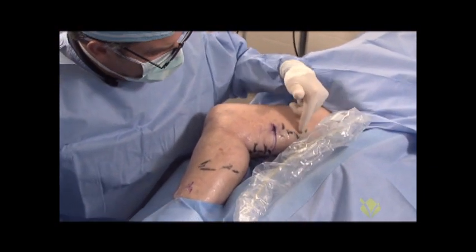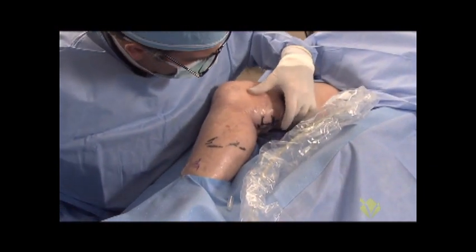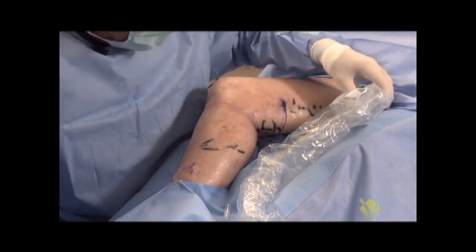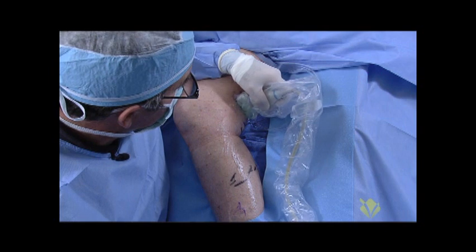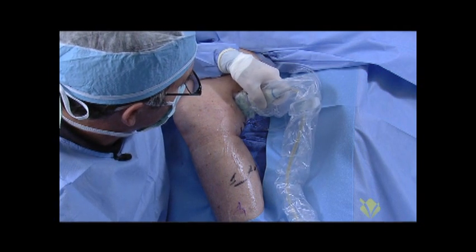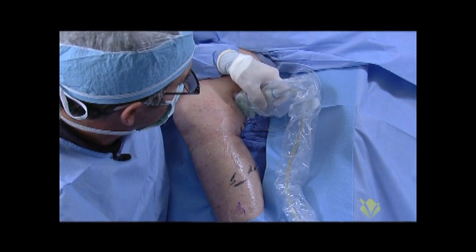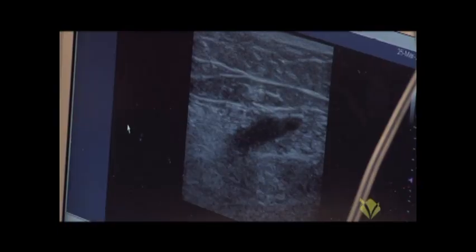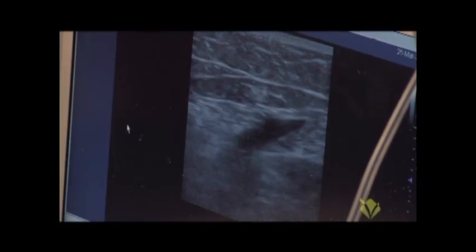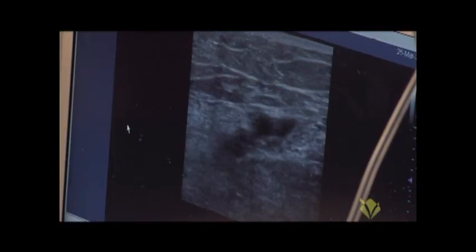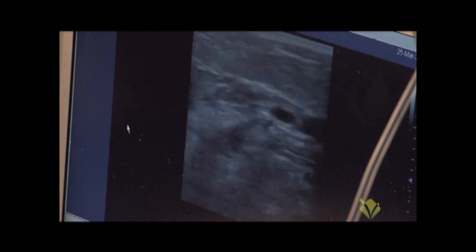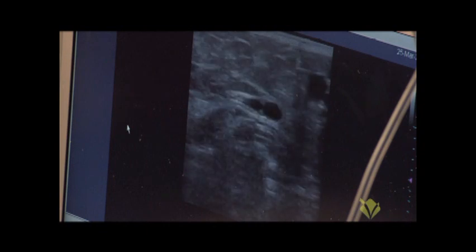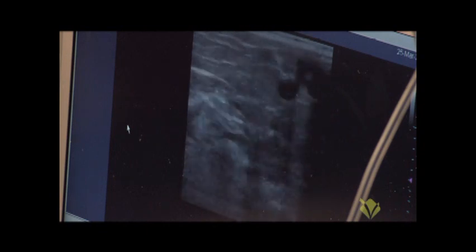You can see the black marks — the black marks indicate the areas of varicose veins — but what she has is two things. She has a large perforator coming off the femoral vein here, and we'll look at it on the screen. The echolucent structure coursing from lower left to upper right, and you'll see as I move the probe down her leg, that feeds directly into the large varicosities just below her skin, just above the knee.